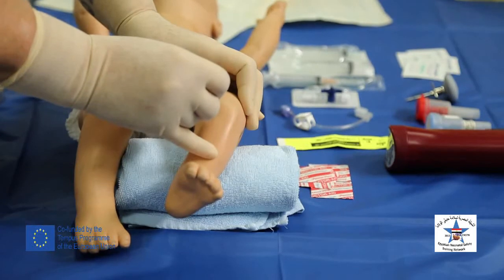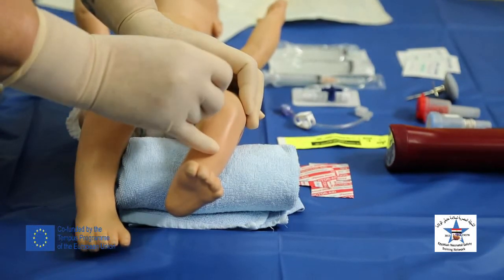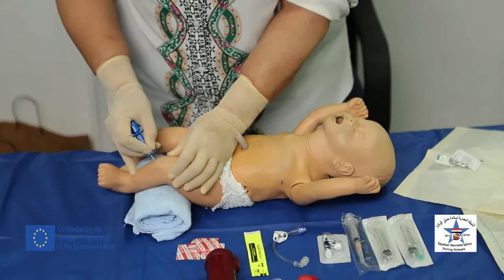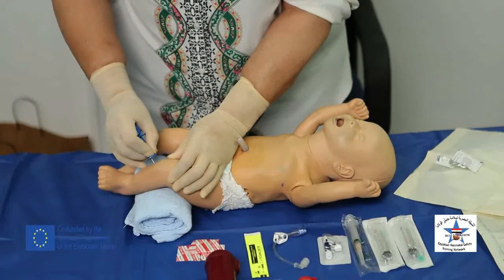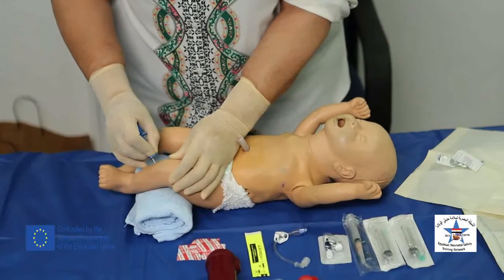This is the periosteal bone. And then with regular sustained pressure and a screwing movement of the needle, puncture the periosteum. The periosteum is punctured when we feel a pop-off or a give-way resistance.